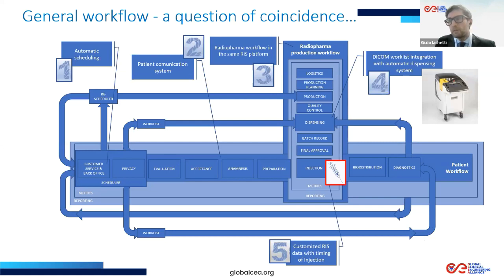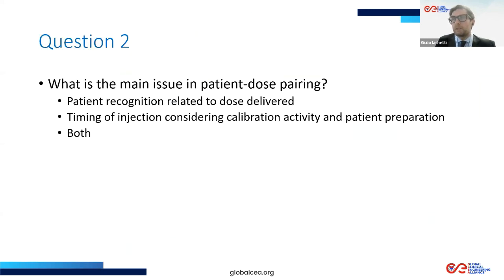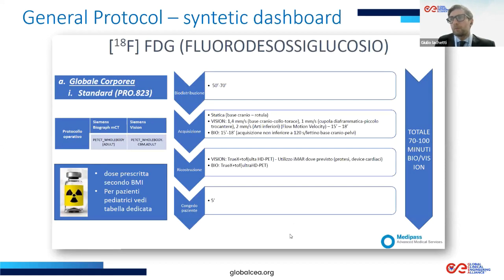It's very important to have the timing of injection, that is the real time you have injected the patient. And I would also underline some, I would say, innovative way of thinking about scheduling. I called it parametric scheduling, but we will speak about it after this question too.